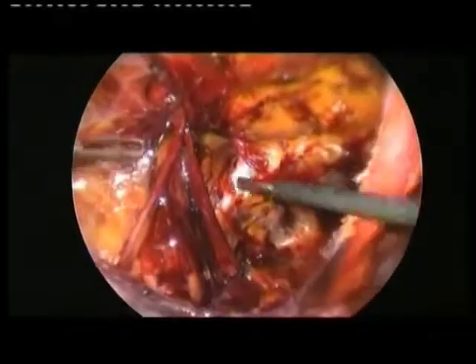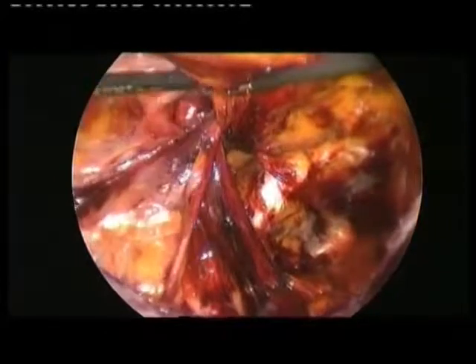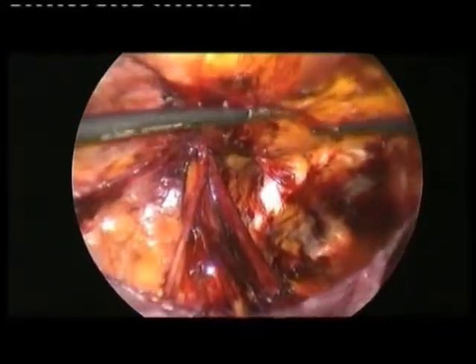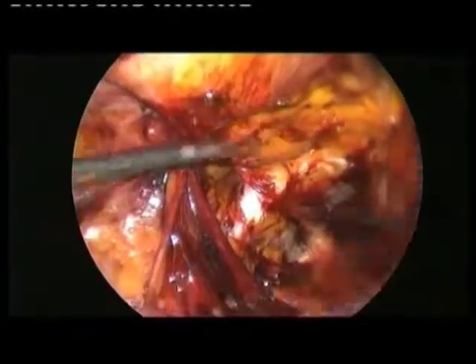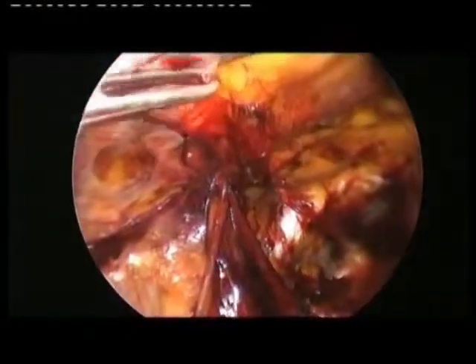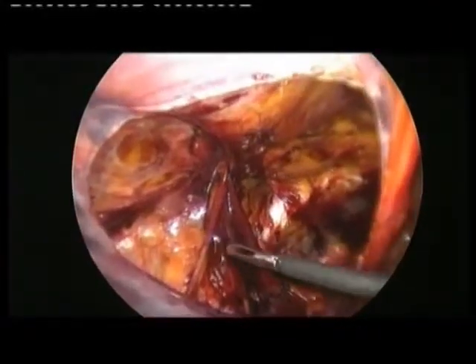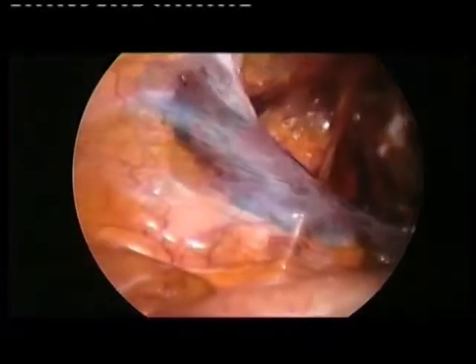So we have to put the mesh. Putting the mesh, we cover this defect, and also the medial aspect, the medial fossa, okay? It's very important to put the mesh 4 centimeters below and 4 centimeters up, okay? So in 10-15 minutes, we can do the preparation. So now I'm going to put the mesh.